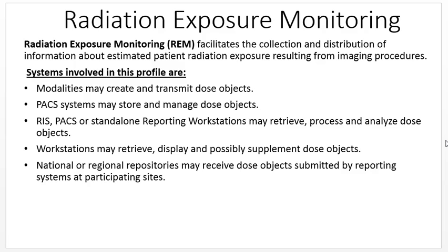The nature of such analysis and format of the reports is not considered a topic for standardization and is not covered in the profile. The profile also describes how radiation reporting systems can submit dose reports to centralized registries, such as might be run by professional societies or national accreditation groups. By profiling automated methods, the profile allows dose information to be collected and evaluated without imposing a significant administrative burden on staff otherwise occupied with caring for patients.